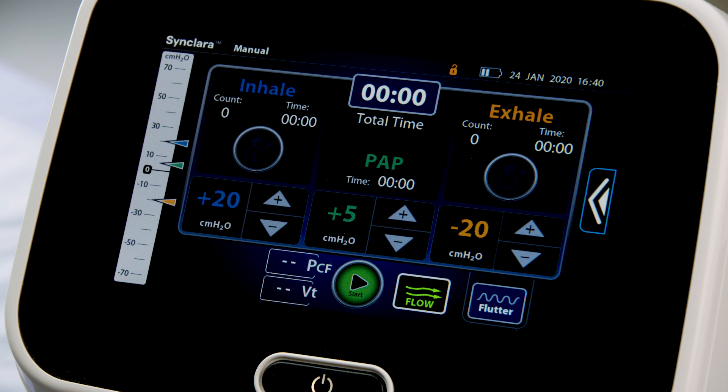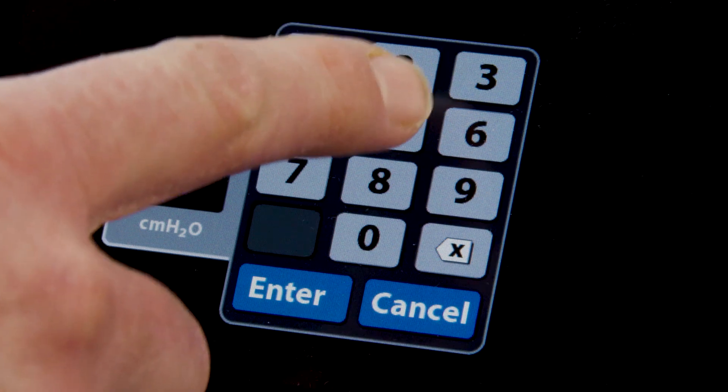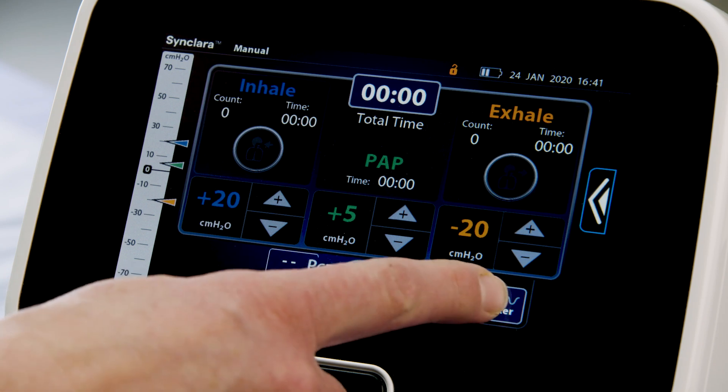When Manual is selected, the screen shows the therapy settings last used on the control unit. If different settings are required, use the plus or minus control, or press the setting and use the keypad controls to enter the required setting, then press Enter to confirm. If pressure oscillation is required, press Flutter.